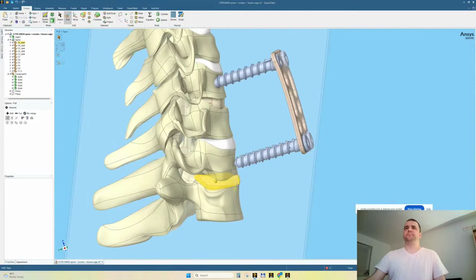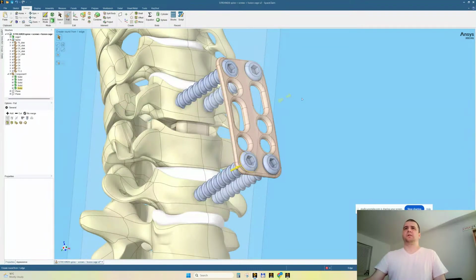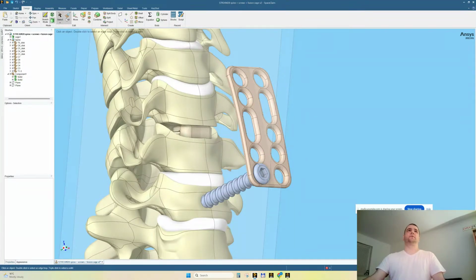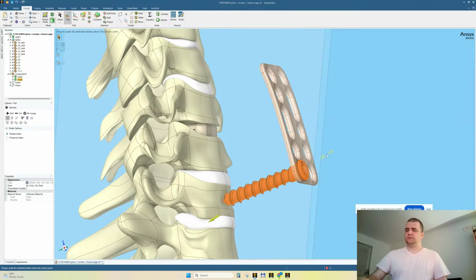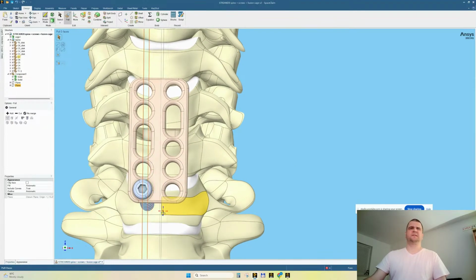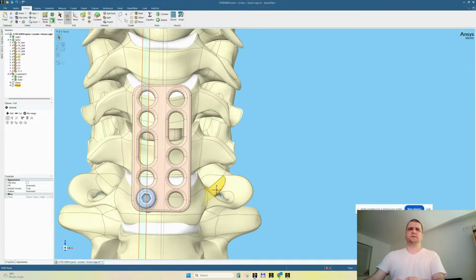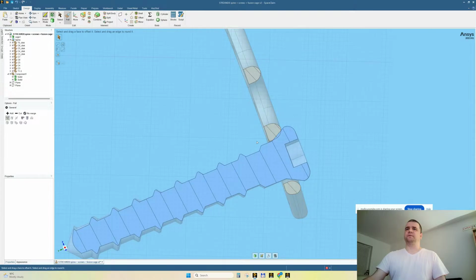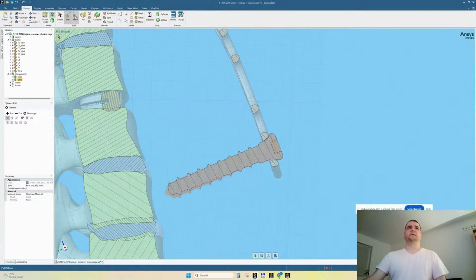Where was I? Let me delete all the screws because I would like to kind of pattern them, yes? All the screws that I don't need. So what did I say? Let's go for anchor point. And let's choose the screw. This is the screw. 0.9? Yes, 0.9. Now we're going to look through the section view. Now I see that it's not so nice. It's not aligned, let's say, with the screw, but let's click section mode. Now the screw is much better. So let me go here and kind of move it.